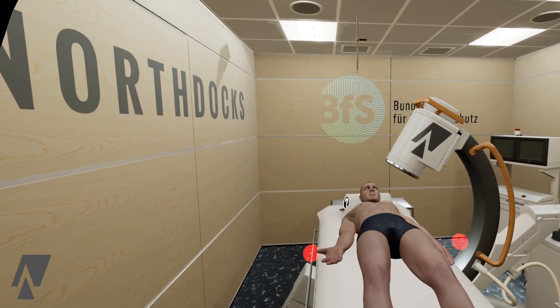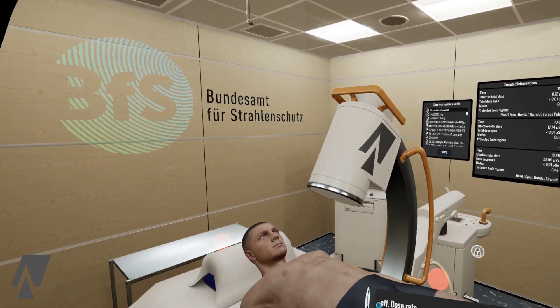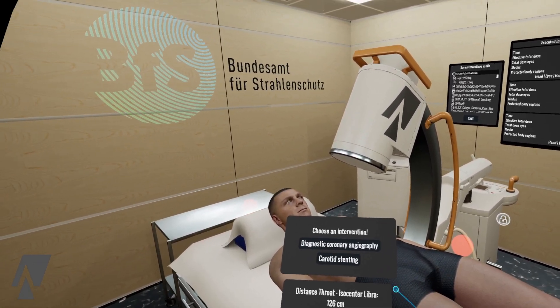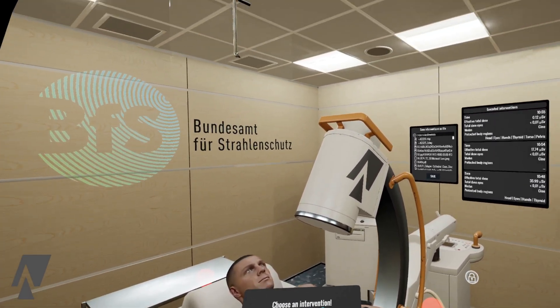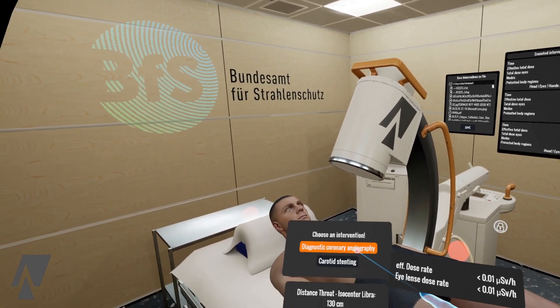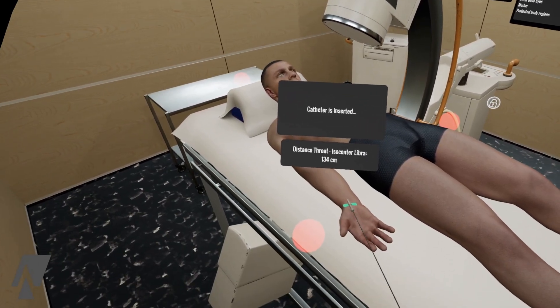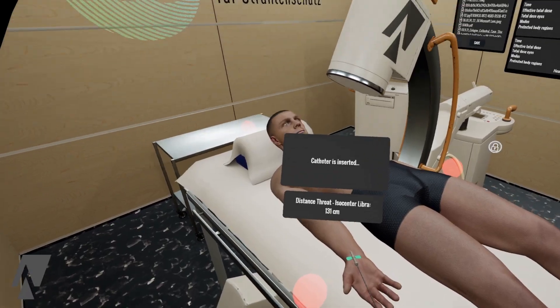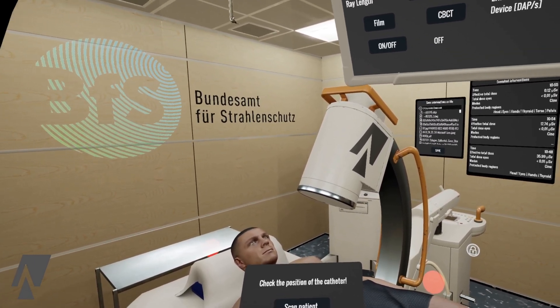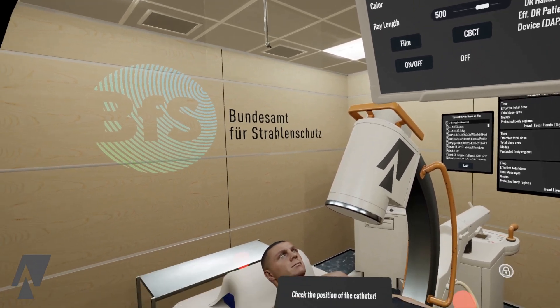Let's move into a more realistic position and let's choose one of two interventions. Let's go with the diagnostic coronary angiography for now. All of the interactions happen automatically so we can focus on the radiation.